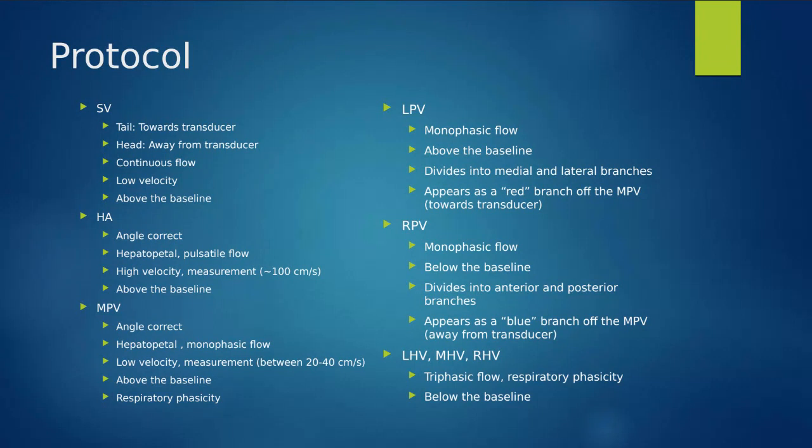So here is how I like to obtain the left hepatic vein. You can obtain it in the view from the previous slide. So right here, that's typically going to be a subcostal transverse view, but it's a little bit hard to evaluate the left hepatic vein in this view. This picture right here, very rare to get that. This is more likely what you're going to get from that view.